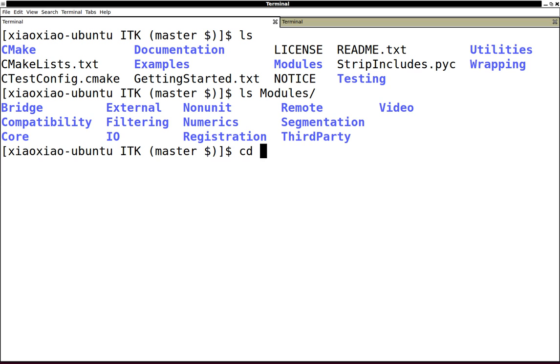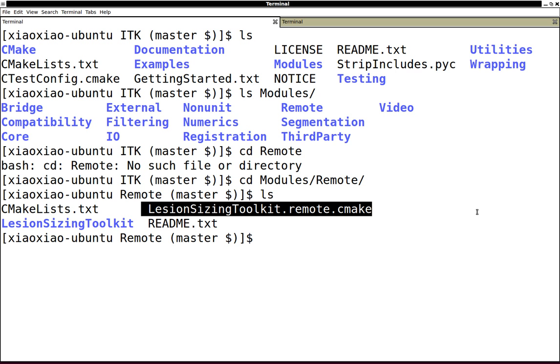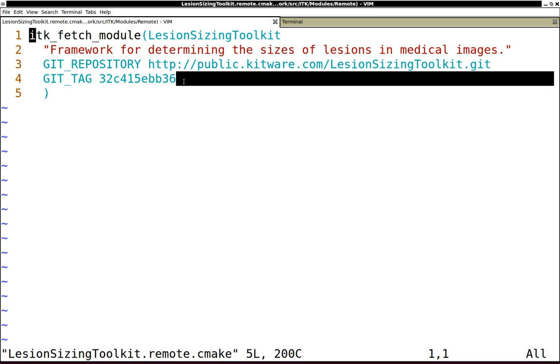You can see there is a CMake file that actually provides a URL to download the source code, which is distributed externally from the ITK code repository. There's also a tag number that tags specific versions of Lesion Sizing Toolkit.